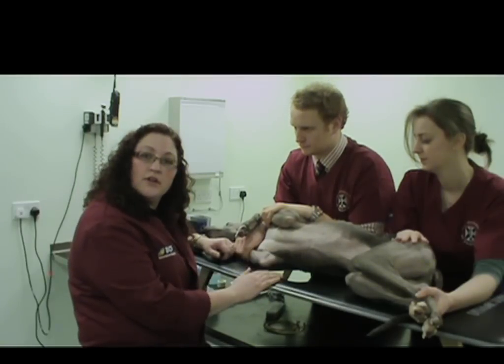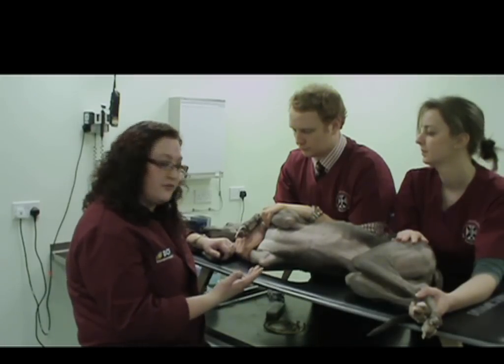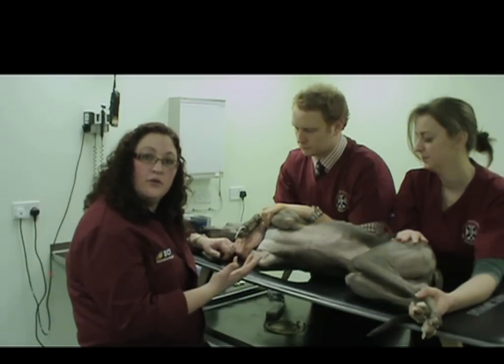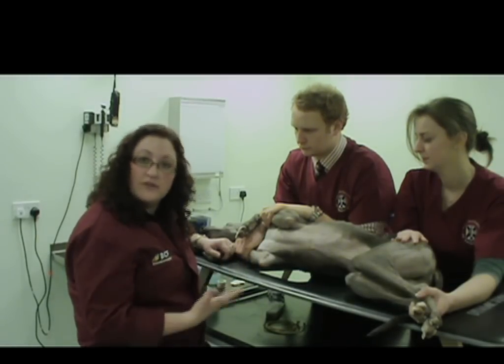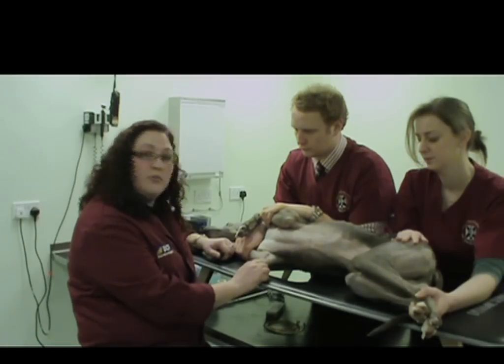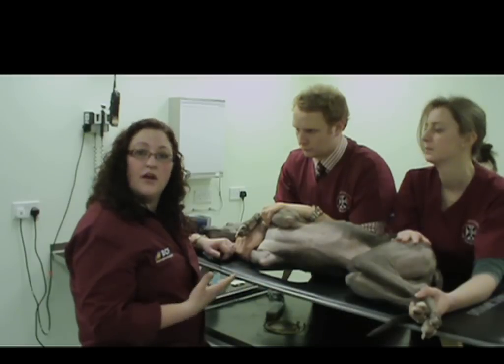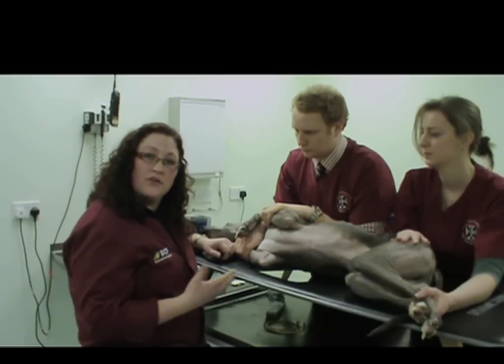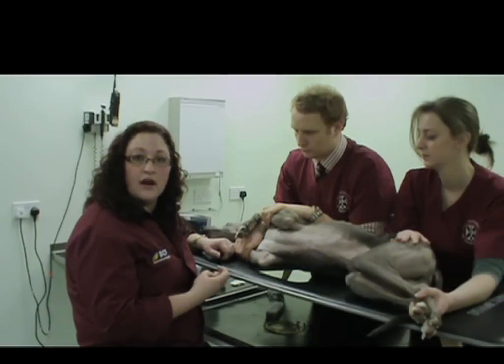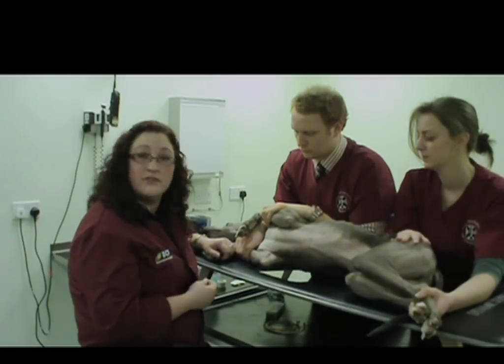Basically, what you can do with a basic echo exam is have a look at various structures within the thorax. Today we will focus mainly on the heart, but it's also important to recognize that in an emergency setting, just putting the probe on the chest of an animal will enable you to look for things such as a pleural effusion — especially in a dyspneic cat that may not be amenable to being placed in lateral recumbency for a radiograph. It's a non-invasive procedure that can be done quite quickly and with little stress to the patient.